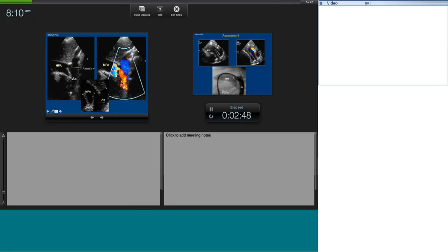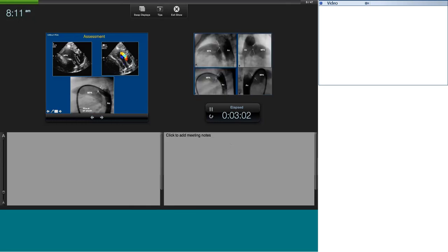The color picture shows flow reversal in the descending thoracic aorta, helping understand how PDAs work. In the diastolic frame, the entire blood goes backwards through the PDA. You can see flow in the transverse arch and the descending aortic flow. The echo-angiogram correlation is very accurate — the same patient's PDA shown in echo and angiography gives almost identical pictures of the ampulla and the narrowest end of the duct.